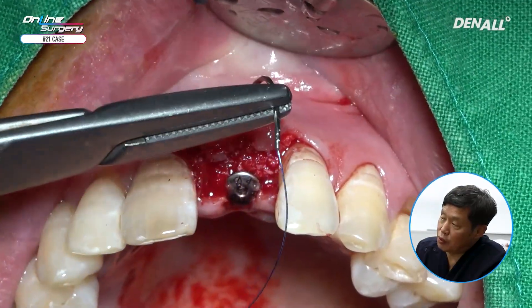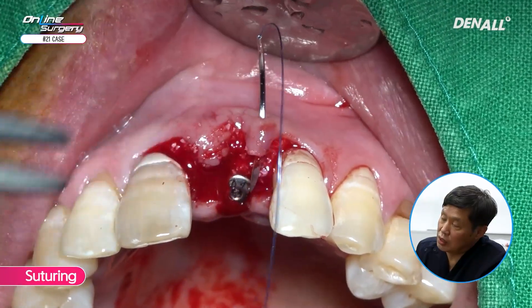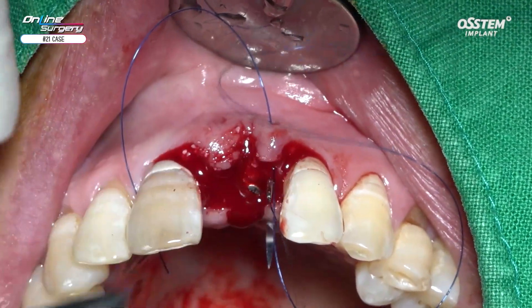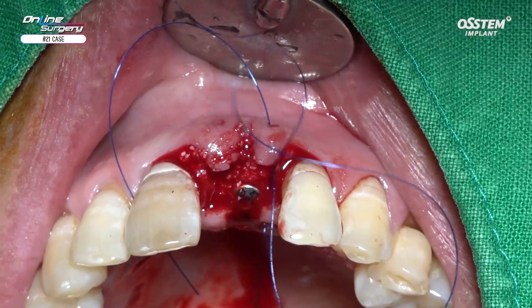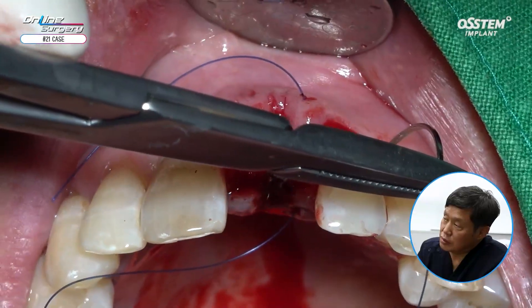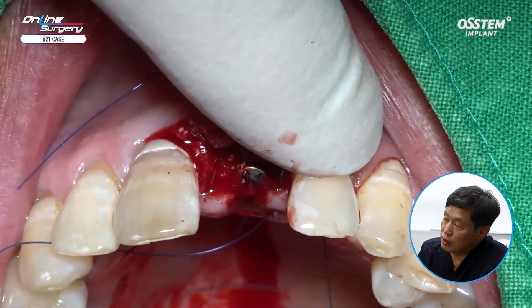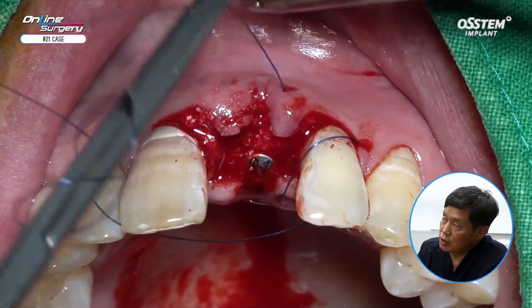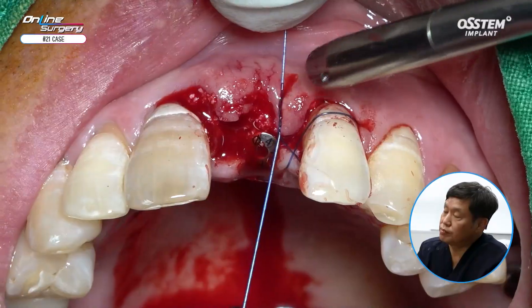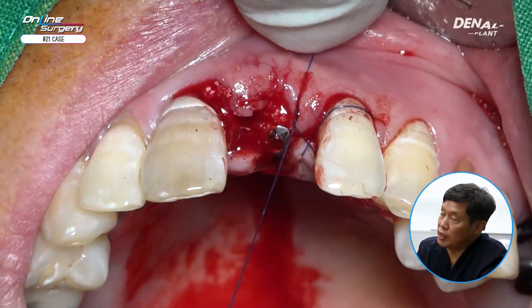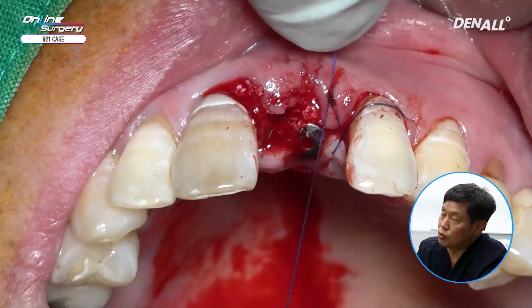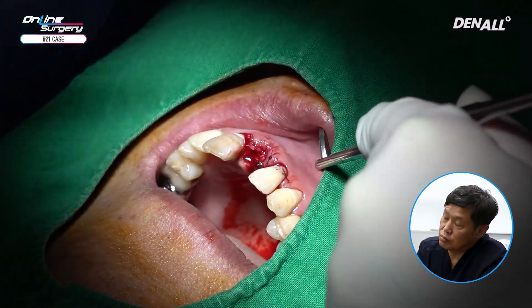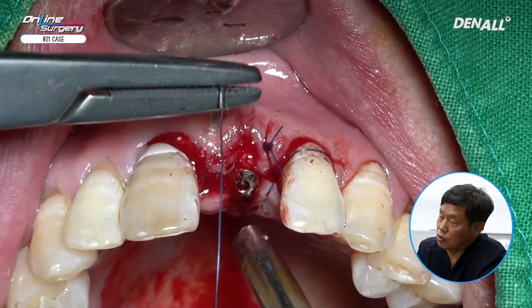Since the ISQ value was insufficient for an immediate provisional restoration, we proceeded with suturing. Because the labial mucosa is thin, we used an anchor suture by utilizing the adjacent teeth to avoid excessive soft tissue damage. We hardly performed periosteal releasing incisions and instead applied a thick layer of AOS Collagen graft in a dual zone approach. Similarly, we performed suturing along the mesial lines in a dual zone approach.